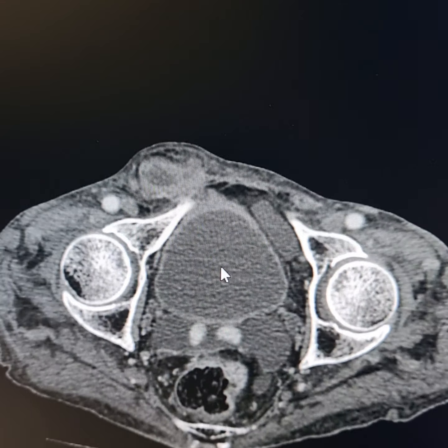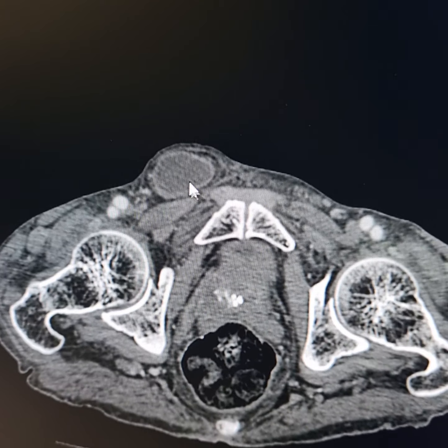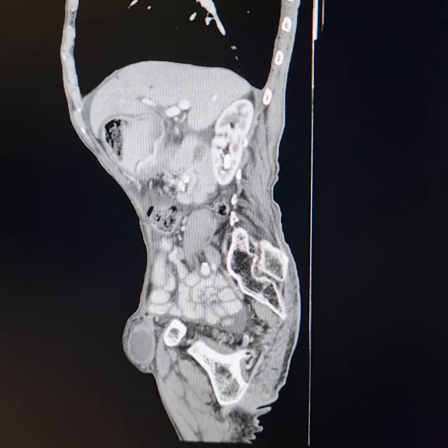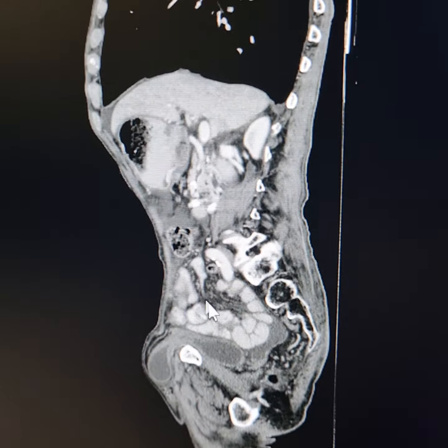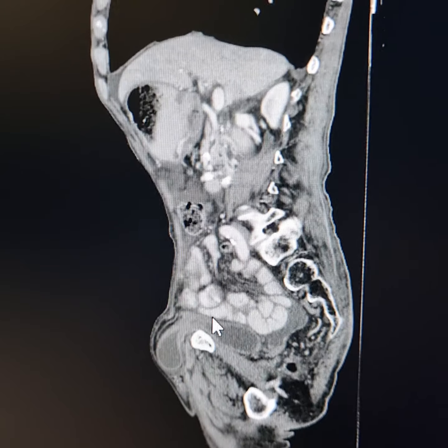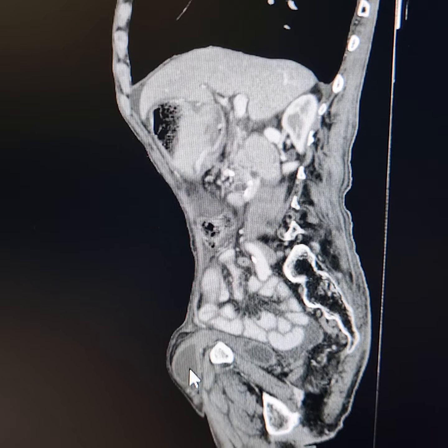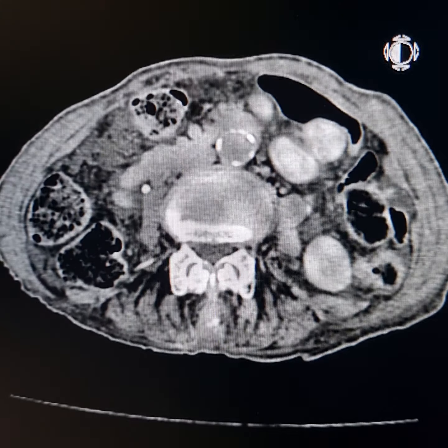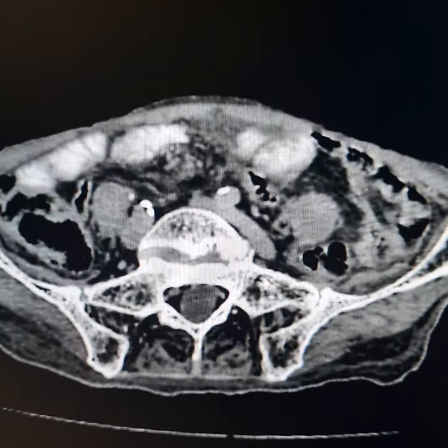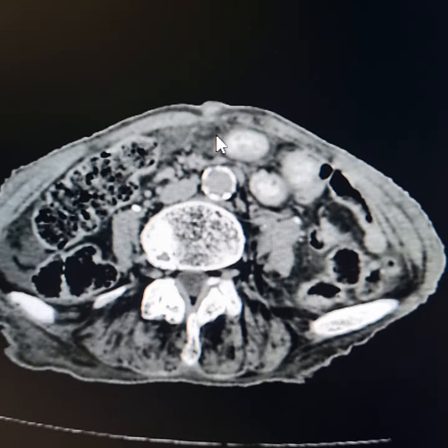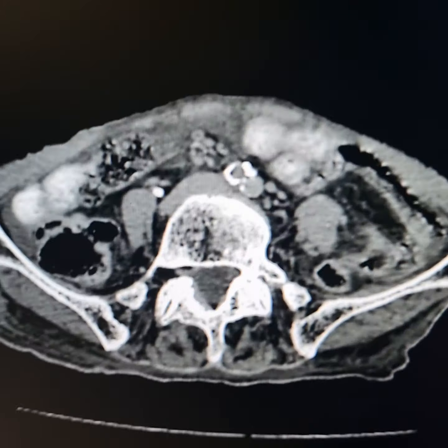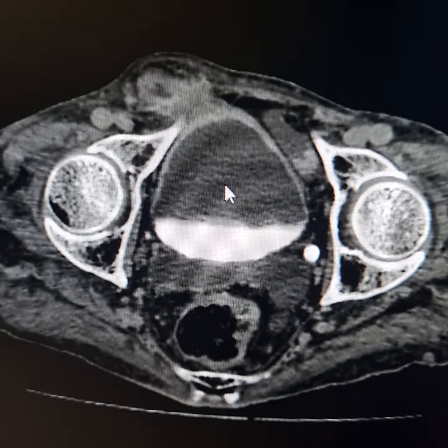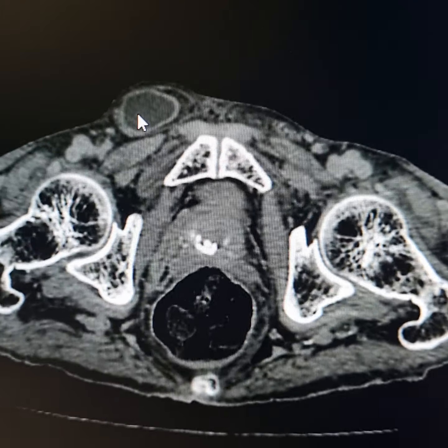It is very rare to find a hernia of the urinary bladder. Please observe this urinary bladder extending downwards, herniating anterior to the pubic bone. This is the delayed scan. The nodule in the umbilicus is metastatic. Thickened greater omentum, and the urinary bladder extending into the direct inguinal hernia.